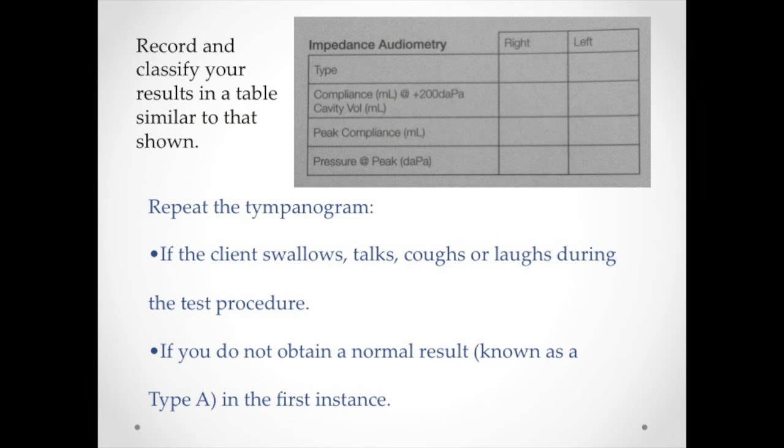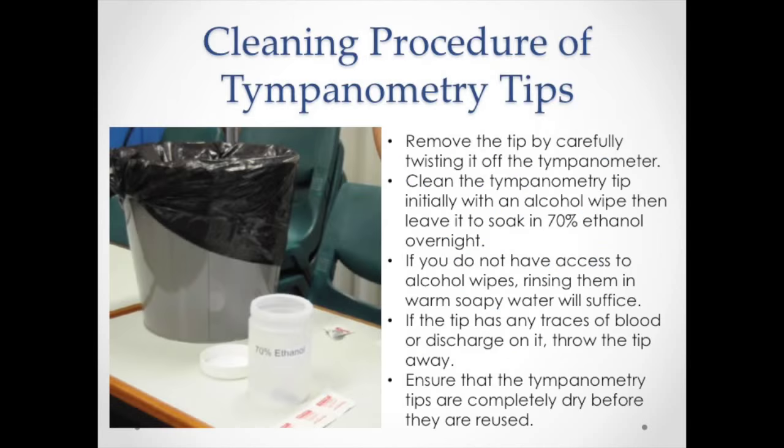Once you've obtained a tympanogram, record and classify your results. Repeat the tympanogram if the client swallows, talks, coughs, or laughs during the procedure, or if you do not obtain a normal result — known as a type A tympanogram — in the first instance. Once you've completed tympanometry, remove the tip from the tympanometer, clean it using an alcohol wipe, and leave it to soak in ethanol before it's reused.